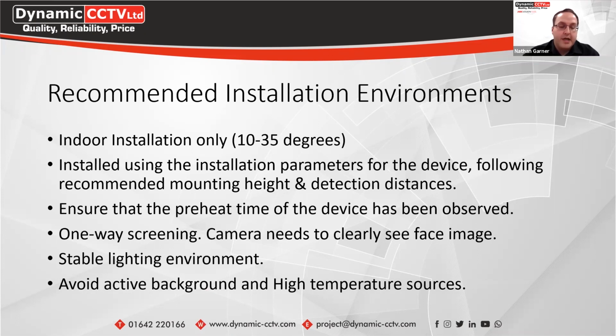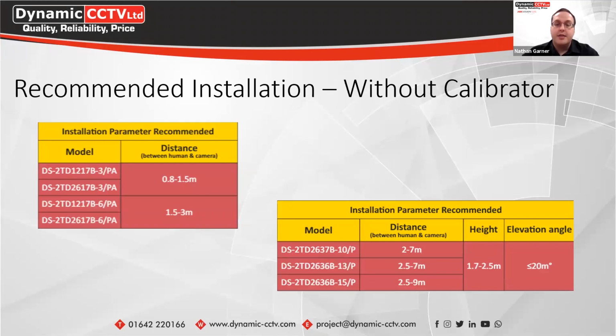We've seen a couple of times when customers have phoned up where they've been getting a couple of false alarms coming through, and that's because of the background in the actual camera image, but it's something to watch out for. So these are the recommended installations for the temperature screening cameras without the calibrators.